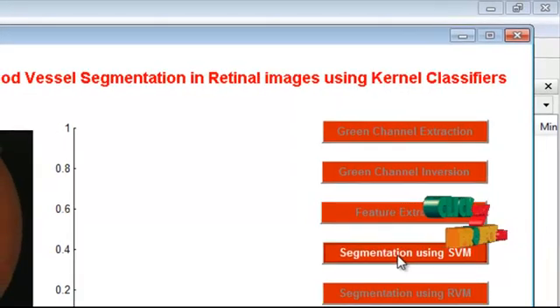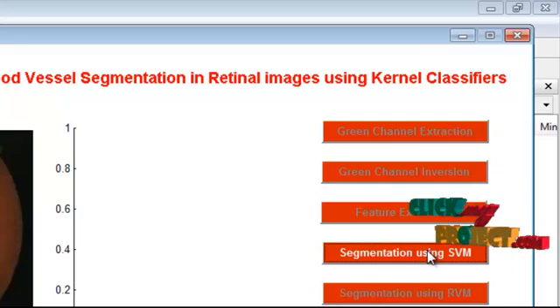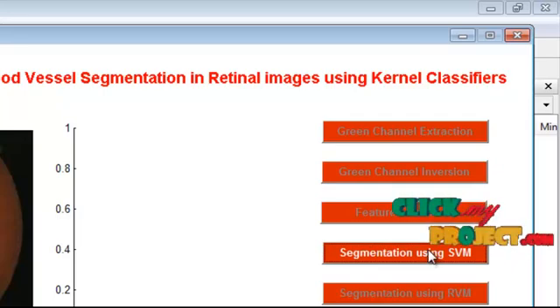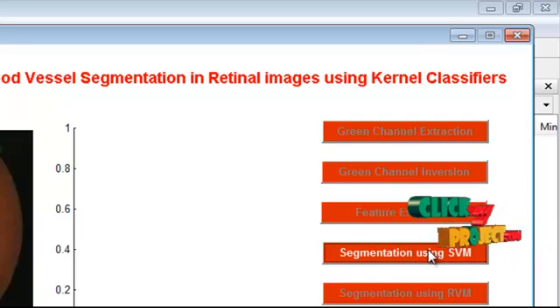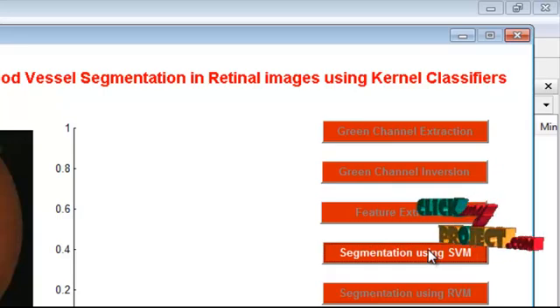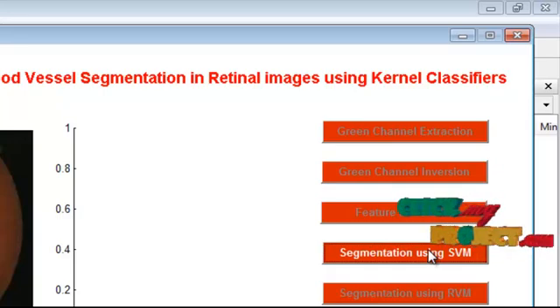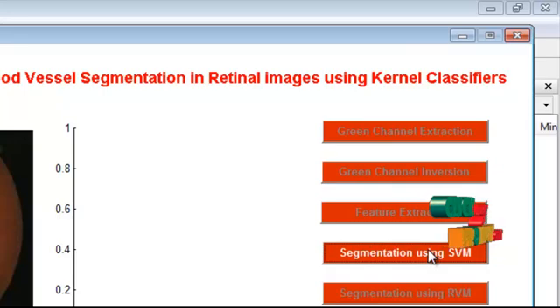Next is SVM segmentation. This process takes time as it has to find the hyperplane that causes the largest separation between the decision function values for the borderline pixels.